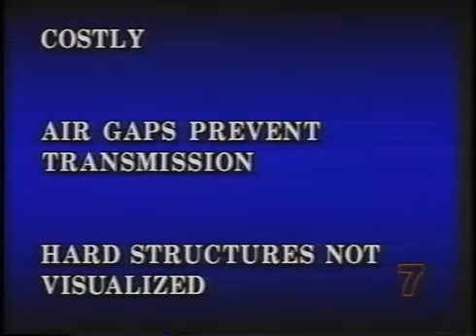Finally, and in the same vein, while ultrasound images soft tissue quite well, it doesn't image hard tissue or bone. And therefore we see the shadows of the hyoid bone and the jaw, but we do not see the structures themselves.